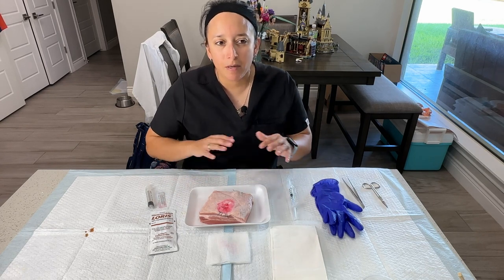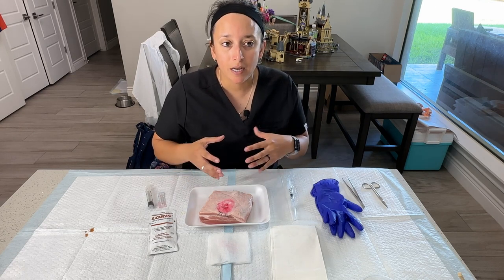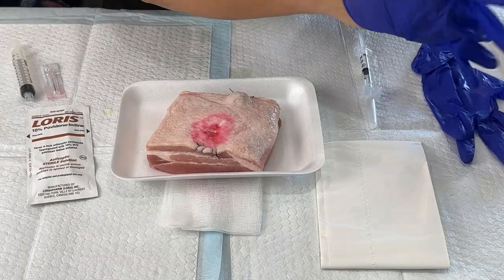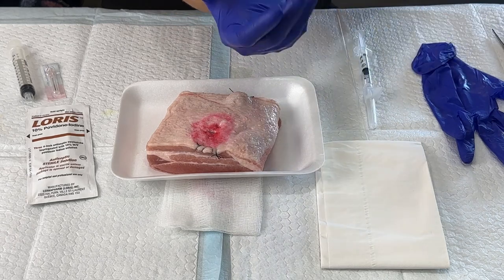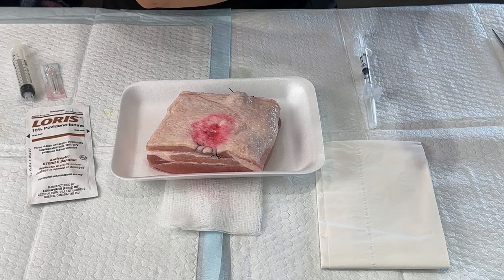I'm going to try to improvise on that since I don't have an intact suture kit to create that sterile field effect. Let's go ahead and get started. Let me go ahead and first put on my gloves. Remember, these would be just the wall gloves that we get off while we're getting everything set up.